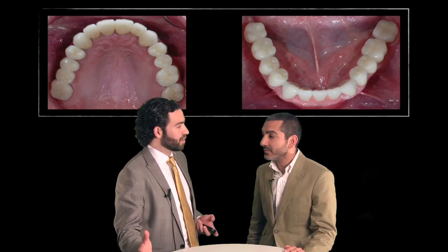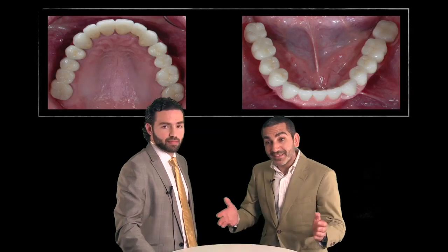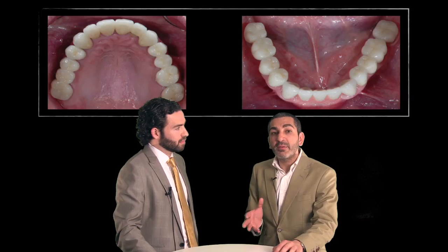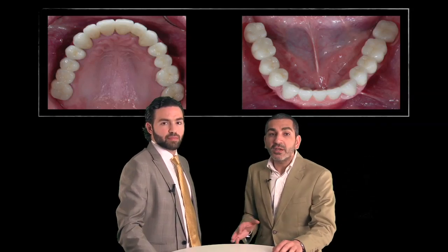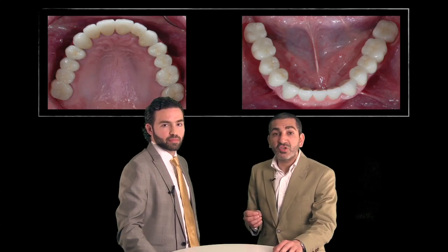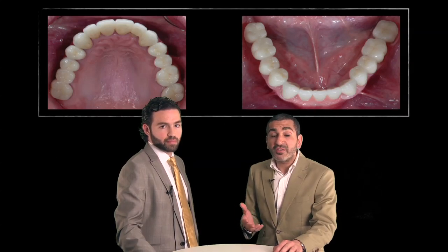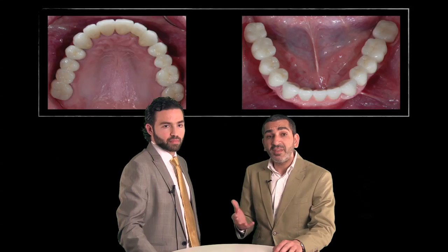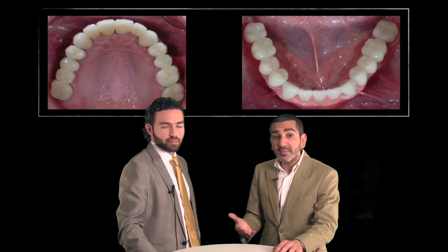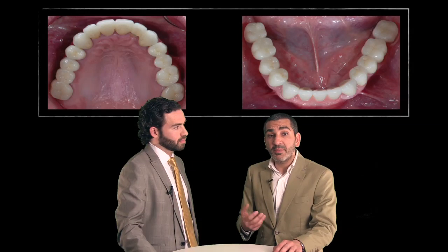However, there's only one drawback of it, Mamali, right? That's right. The drawback, obviously, in 2011 again, is cost. Gold is fairly expensive, and that's why we've been forced to go and start using all these all-ceramic systems. But please consider the fact that these restorations have a low failure rate, and other restorations, particularly on molar teeth, as you've seen, have a higher failure rate, don't they? Yes. And because of that, the cost of replacement, the chair time, might be actually offset or be a lot more than the cost of doing a PFM.